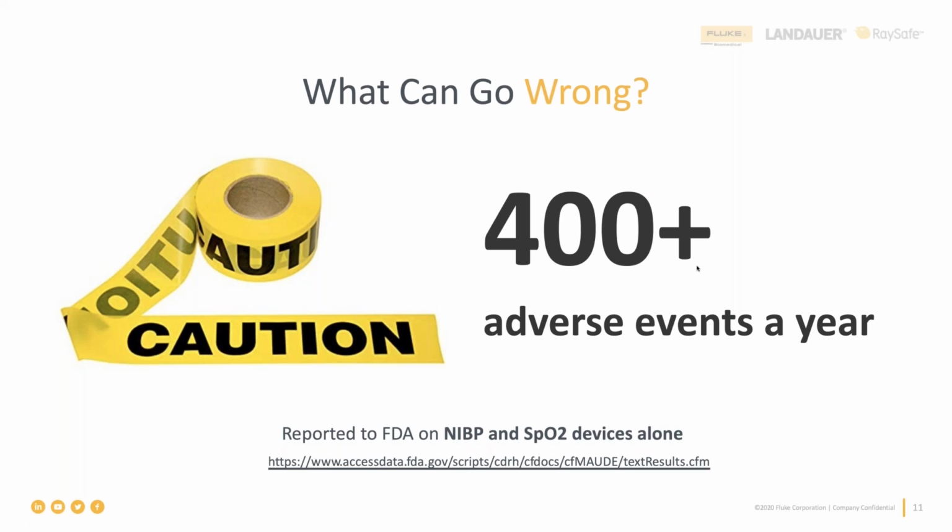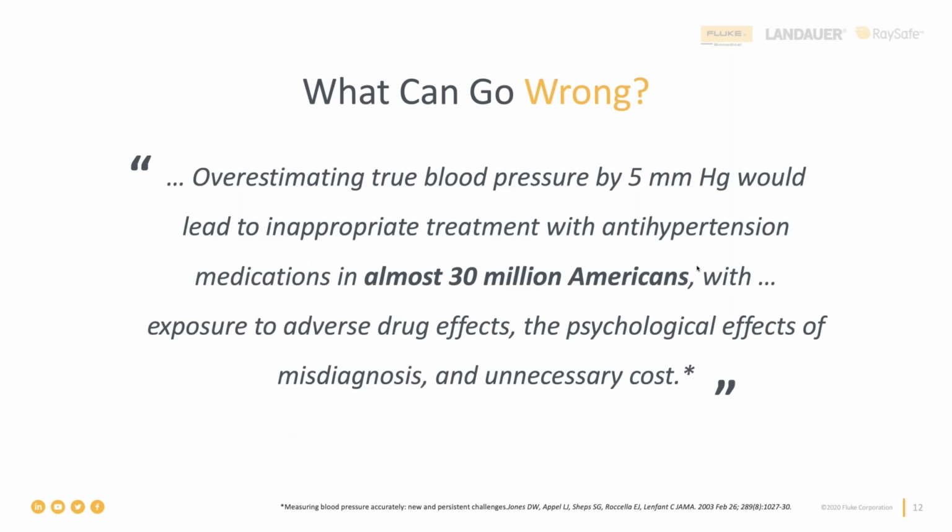And our goal here is to prevent all of this from happening by testing patient monitors and making sure that they operate properly. And here I would also like to give a couple of examples of what failures in patient monitor parameters can lead to. And again, this is based on data. And this data particularly pertains to non-invasive blood pressure measurement, or NIBP.